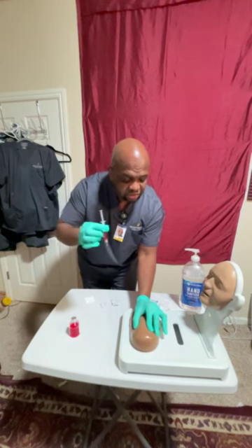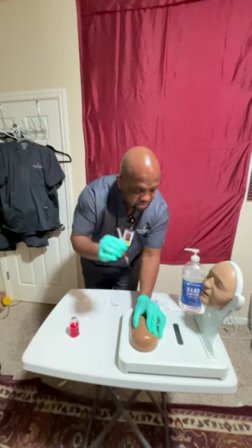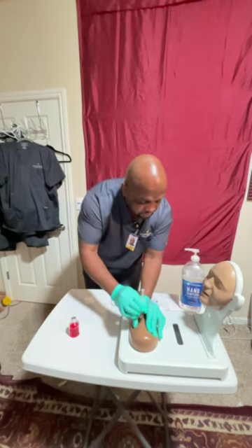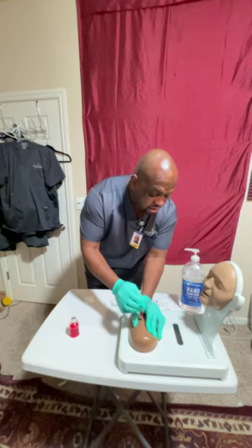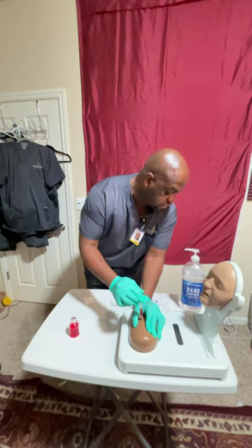I'm going to squeeze that muscle area there. 90 degrees, kind of firm. And Mr. Jones, it's going to be like a stinging sensation. Here we go. Take a deep breath. 90 degrees. And before I even inject the medication, I'm going to wait a bit, maybe about 5 seconds, and I'm just going to aspirate on the syringe.